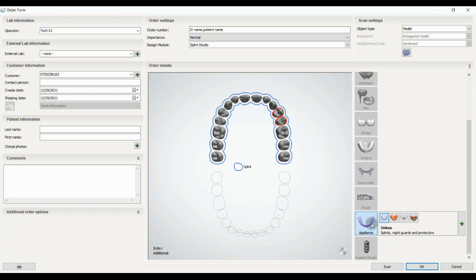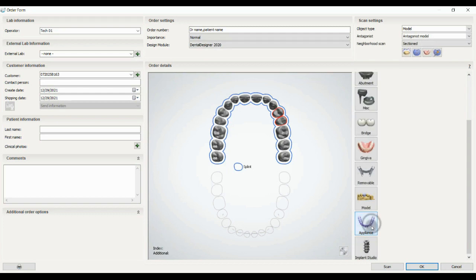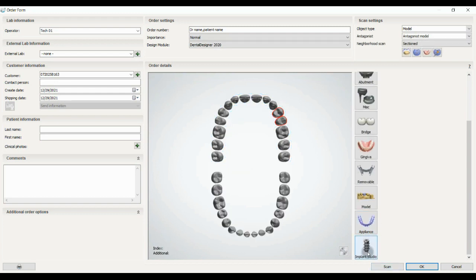And the last one is implant studio that will direct you to the implant studio software, which is software for designing surgical guides or implant positioning.